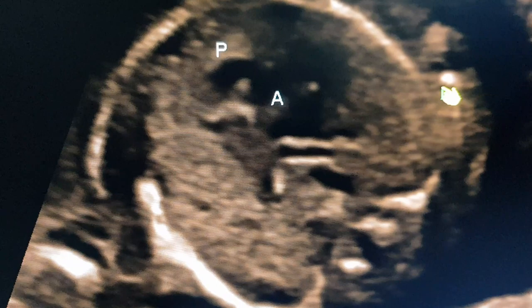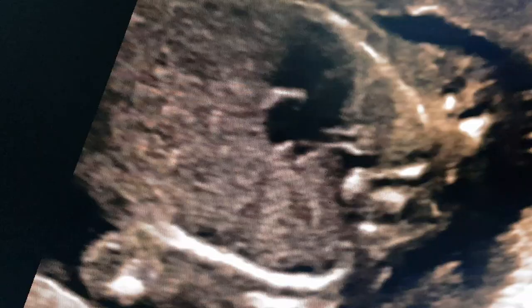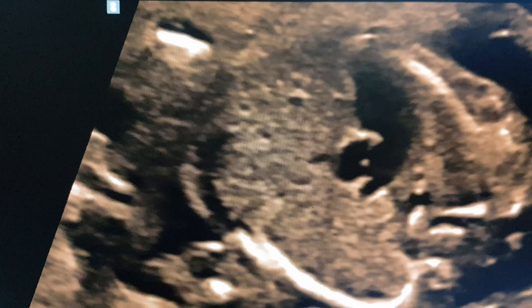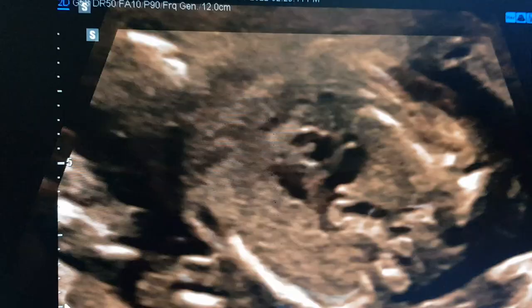We go into our sagittal images to get the SVC and IVC and then we try to get the outlets to look at the anatomy. We have confirmed that there is tricuspid atresia, a completely hypoplastic attenuated right ventricle, with a three-chamber type of single ventricle morphology heart.